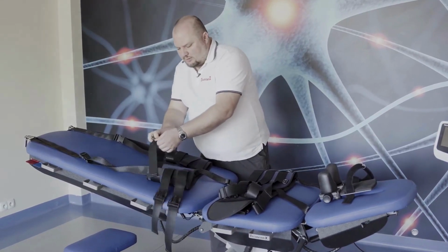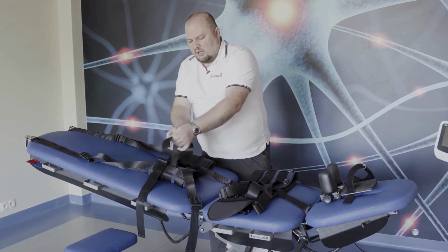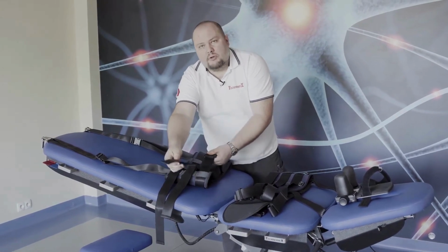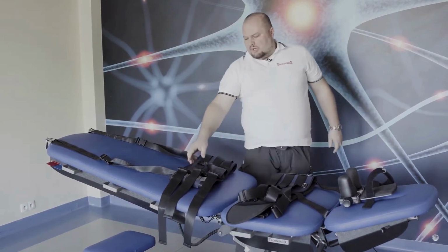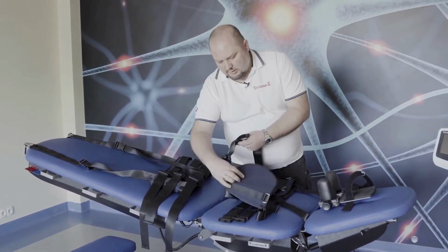In this case, we must connect all of the strips, but 2 of them, the upper ones in the lumbar belt, we place very tight, we tense very tight. The third one, not necessarily. The same situation is in the thoracic belt.